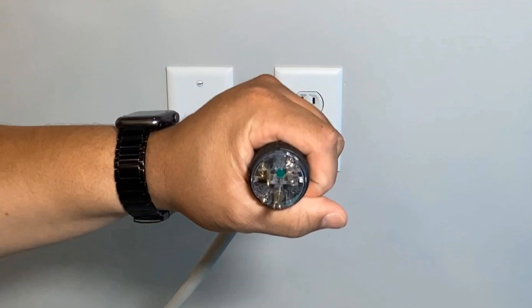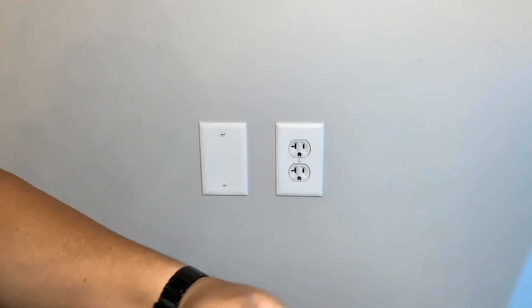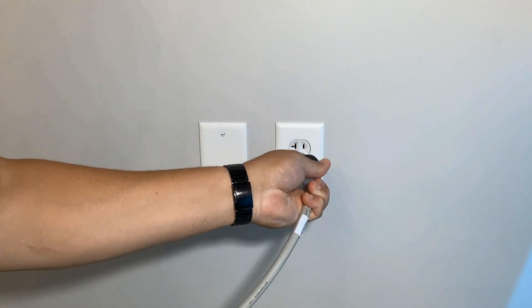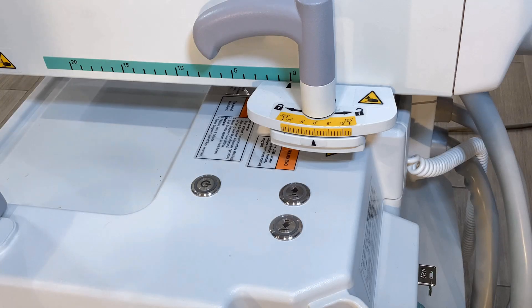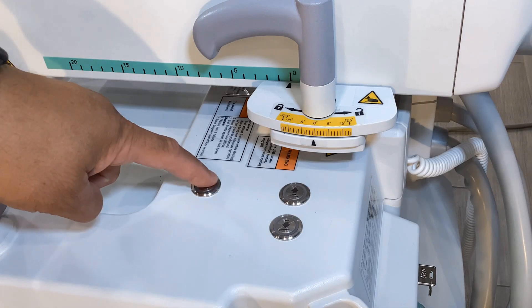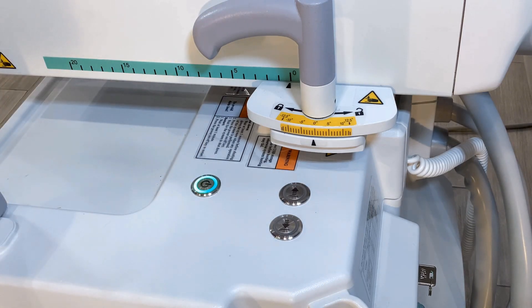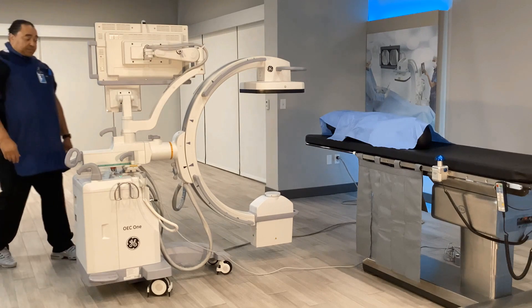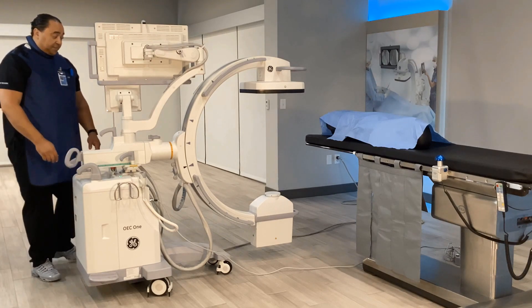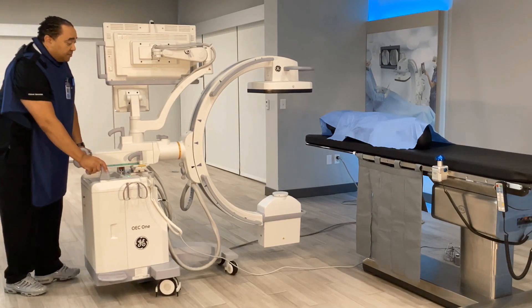Plug in the system. Notice it has a 20 amp plug. Power on the system by holding down the silver button until it blinks green. Move the system into case start position and lock the brake.